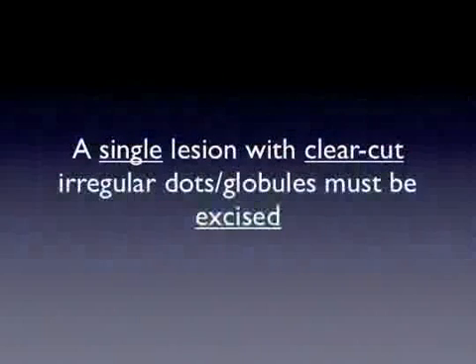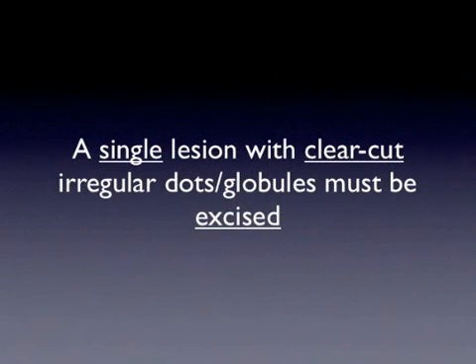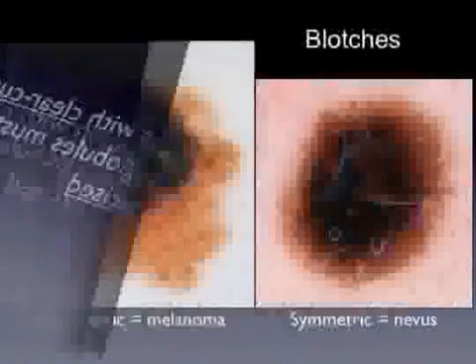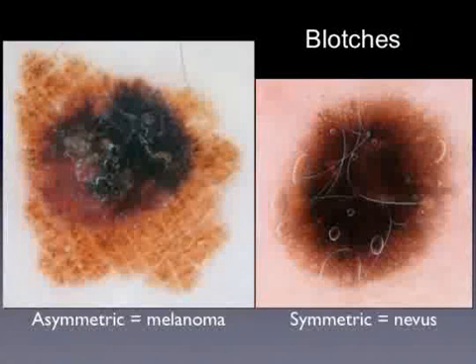Here, a melanoma in which the most striking and diagnostic feature is represented by asymmetric globules varying in size and color. Thus, a single lesion with clear-cut irregular dots and globules must be excised.